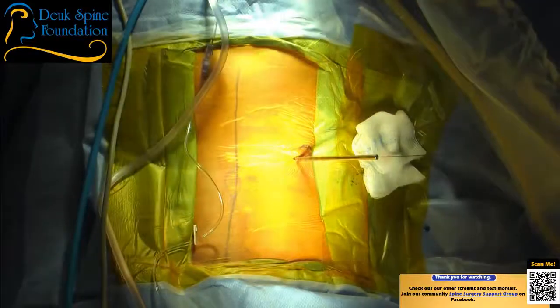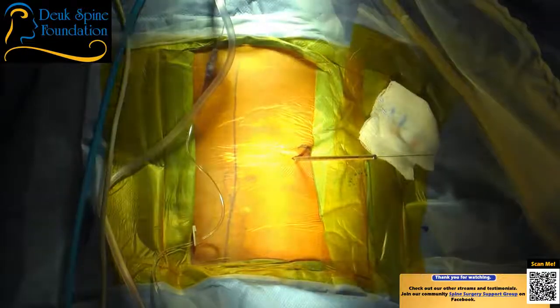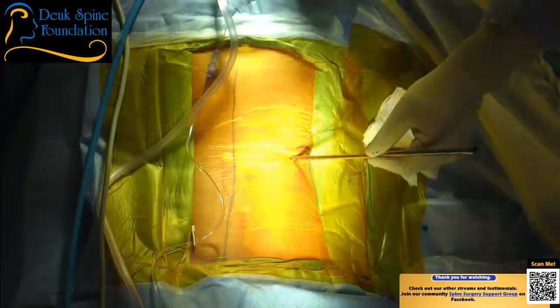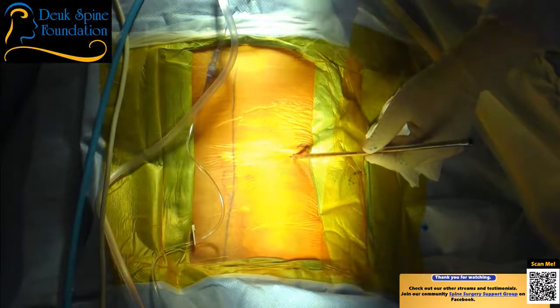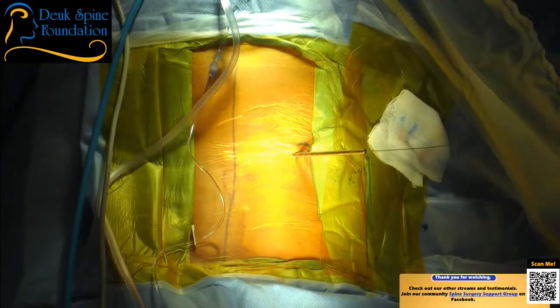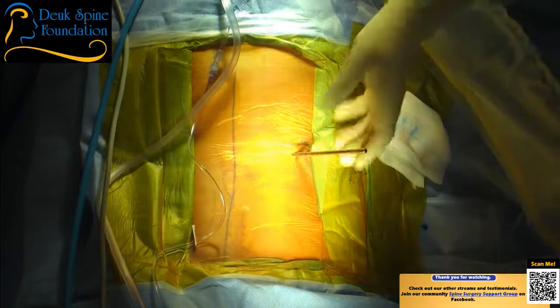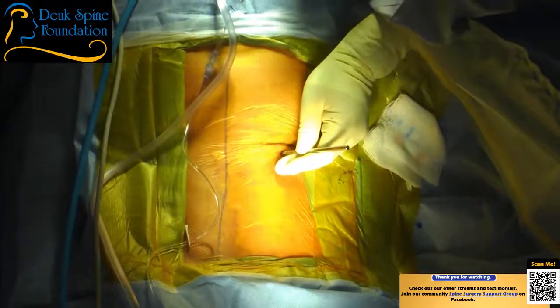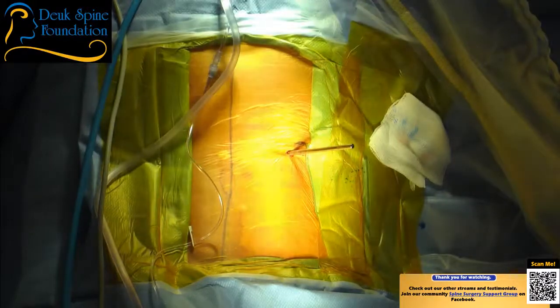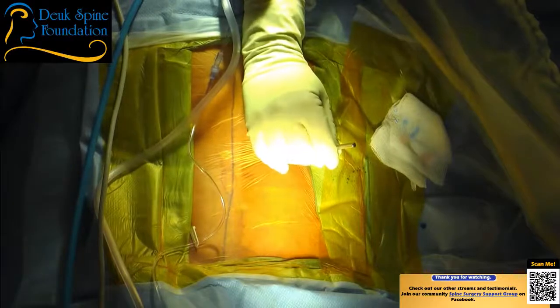We're right on the back of the disc with the dilator, and there's a huge tear back there in the back of the disc. Now we're going to enter the disc — at L4-5 — right where the herniation is. Are we creating more damage to the disc? No, because we're going right where the damage already is. That's one of the advantages of this technique — we're not creating any new damage.